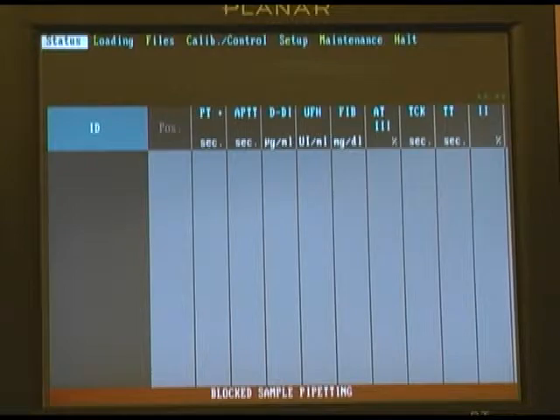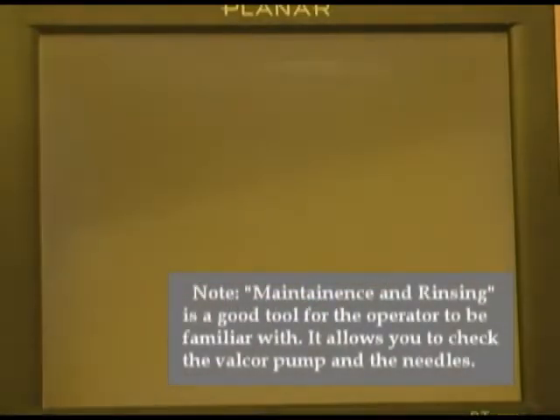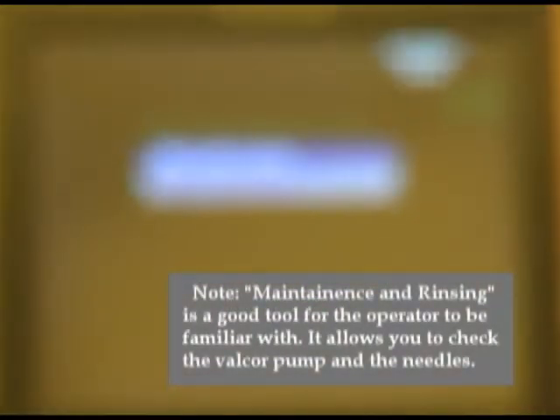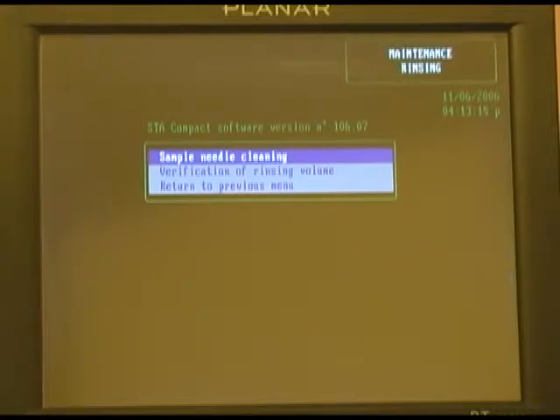The next series of utilities we want to go over are maintenance. The first option is rinsing pump. Rinsing pump allows the system to verify the rinsing or cleaning hydraulics within the system. It also allows you to perform the needle cleaning procedure as defined in the user maintenance section and also in the hospital standard operating procedure for doing needle maintenance.